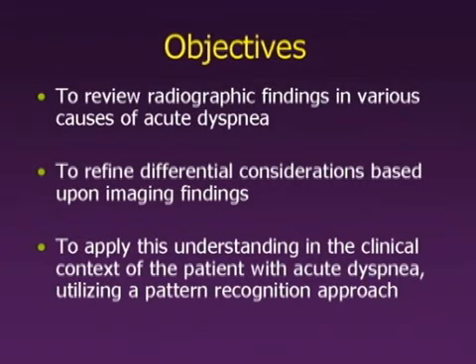to review the radiographic findings in various causes of acute dyspnea, and by so doing, to refine differential considerations based upon these imaging findings, to apply this understanding in the clinical context of the patient with acute dyspnea, utilizing a pattern recognition approach. What is dyspnea?